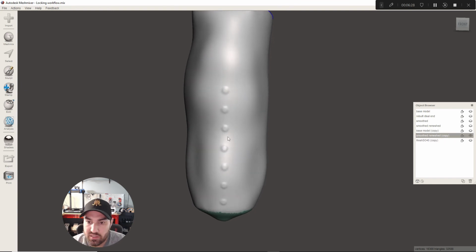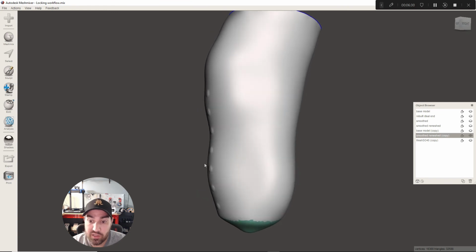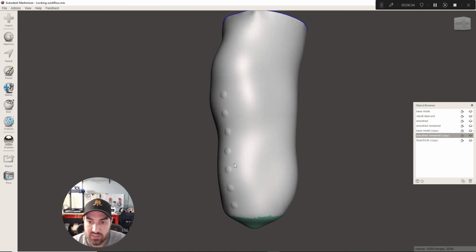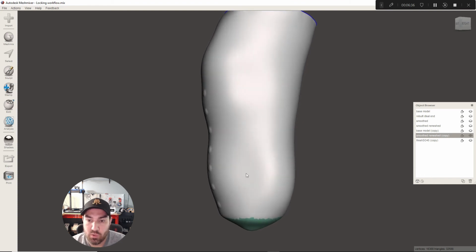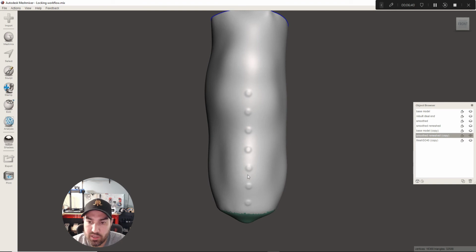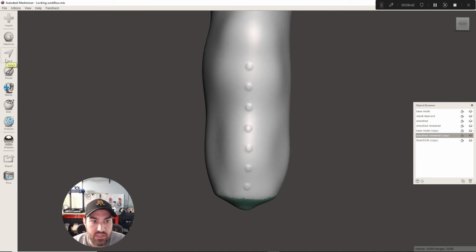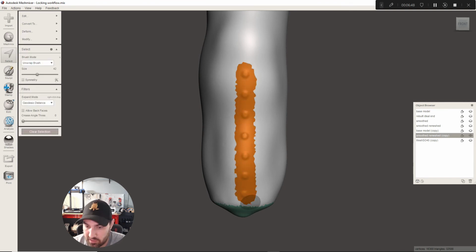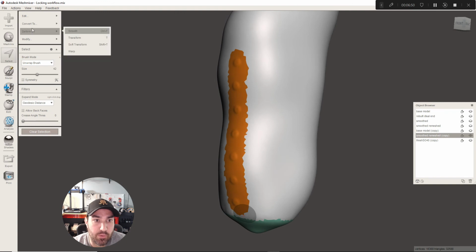these. So these are going to be test sockets. Someone else is fitting these. That was their cast. So I'm not really sure how this equates exactly to my measurements. So what I want to do is just send them what I thought my modifications were going to be. And then I'm going to send them a second one that's just going to be a reduced version based on knowing that I didn't really change my volume at all.